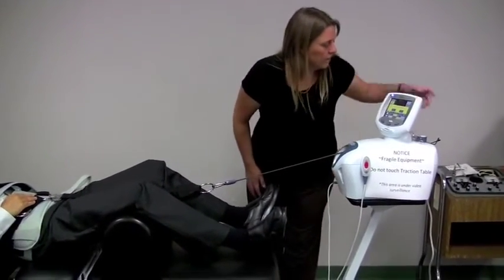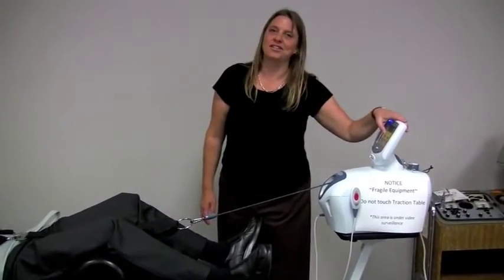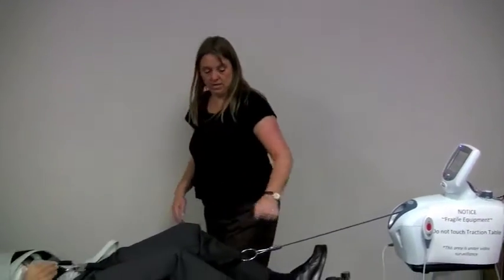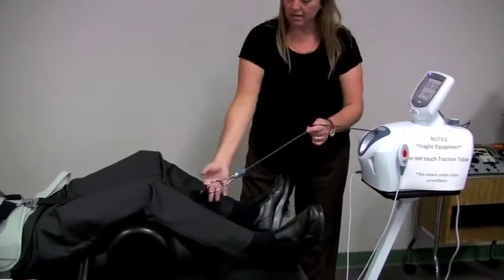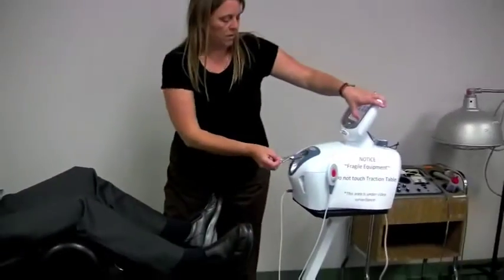Traction's over. Do you want to save this to your patient treatment card? No, I don't today. Let's go ahead now and watch him get off of the table. So I need to, again, use this rope release. Make it loose, lock it loose, unhook it, bring it down, and it's probably better to put the rope away.